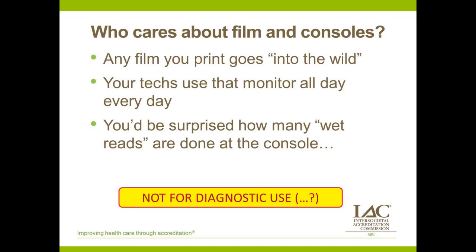And I can tell you, when I spend 4 to 6 hours at a monitor that winds up failing the test, I'm having a bad day by the end of that 4 to 6 hours. So, do a solid for the people that are doing the hard work on the front lines and make sure you get a good, crisp monitor that's bright enough that they can see what they're doing.